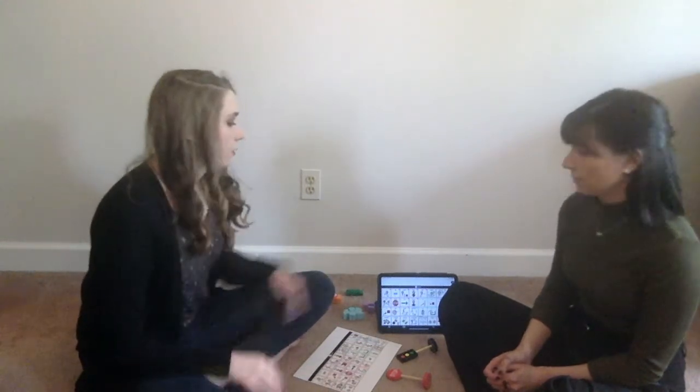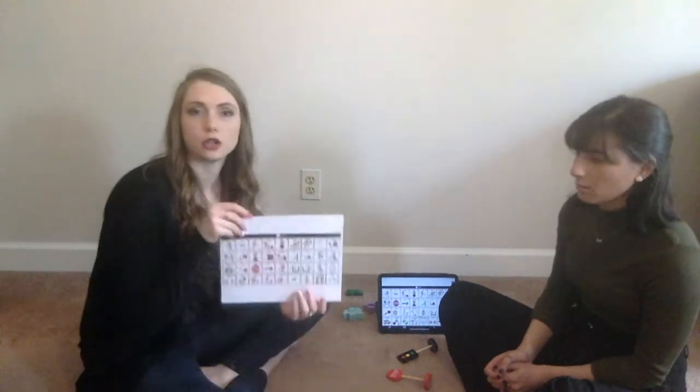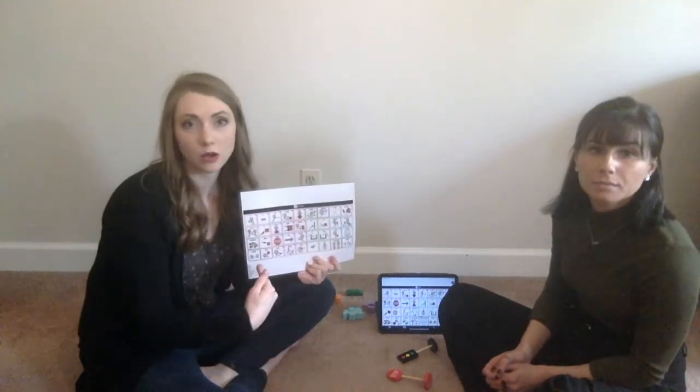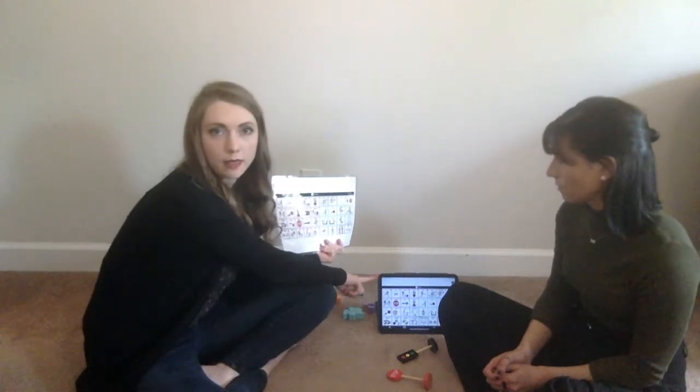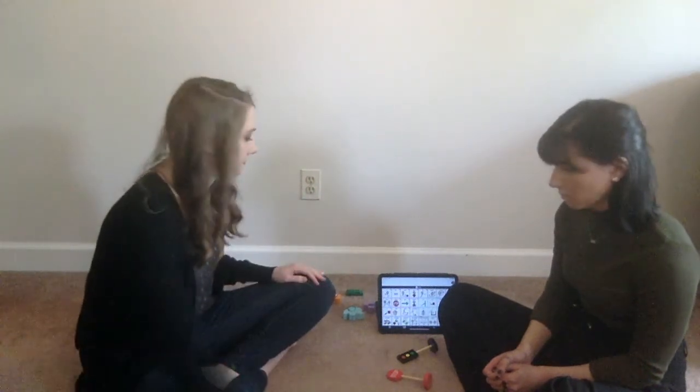And we're going to be showing you how you can use Proloquo2go and model it during an unstructured activity with your child. So today Alyssa is going to be the child and I will be the adult. We have our communication device here. First, I'll show you how you can do this if you have a printed out copy of one of the pages. I just screenshot the first page and then print that out on my computer. And then I'll show you, if you didn't have this, how you can still model using the device.